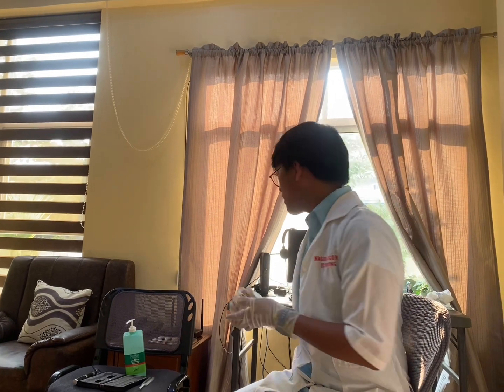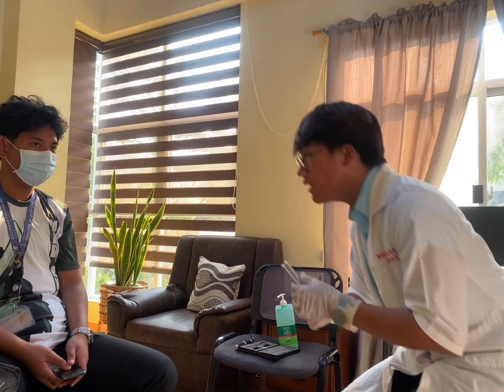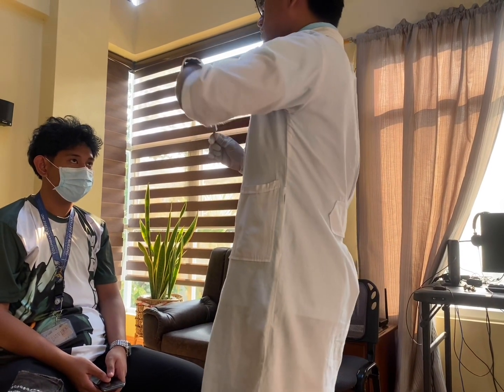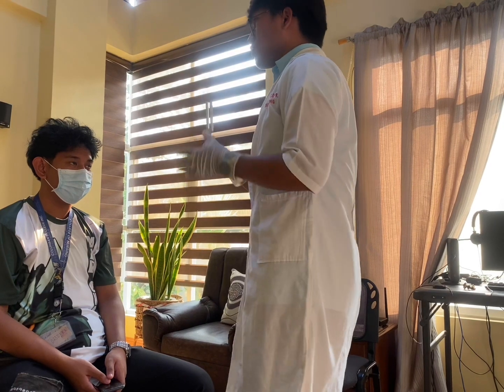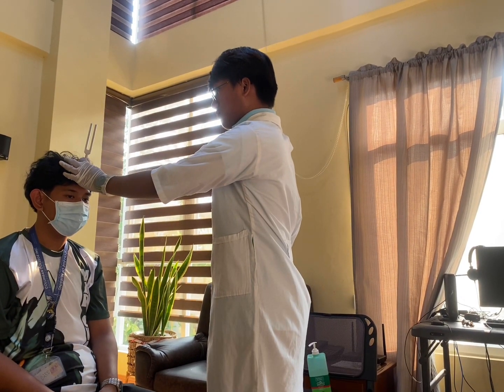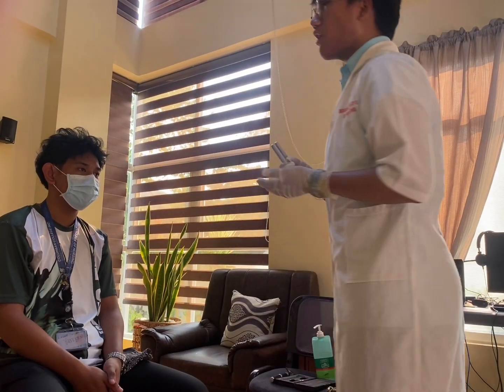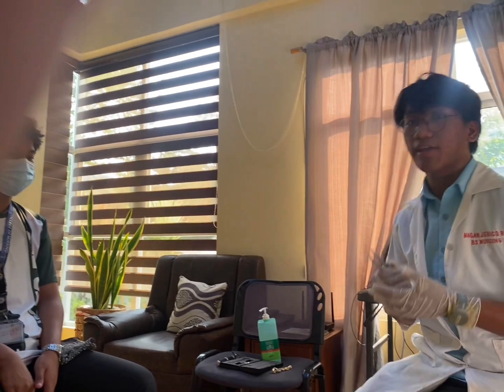Next, I'll be doing a Weber's test using my tuning fork. Okay? I'll be performing Weber's test to check for lateralization of sound. Naririnig niyo po? I observe the sound is perceived equally in both ears of the patient.